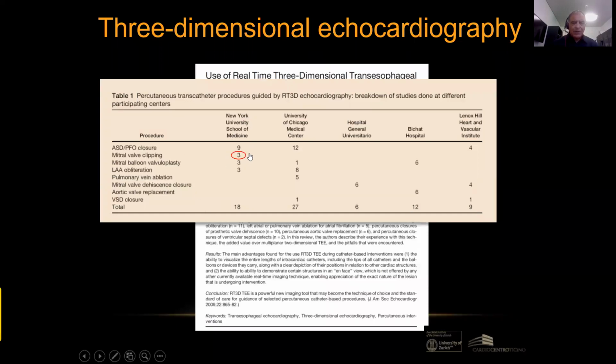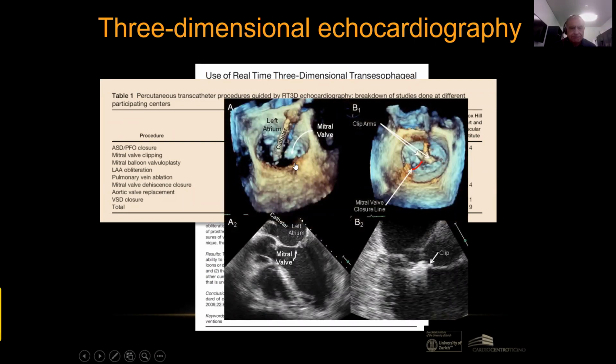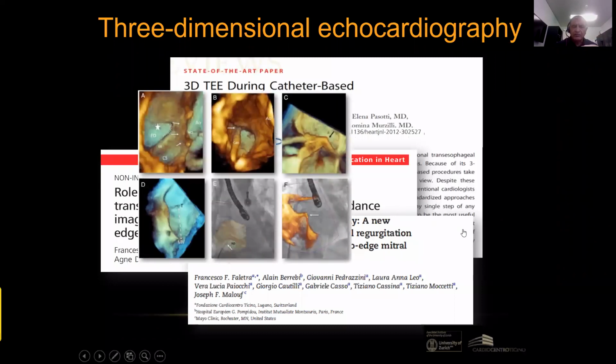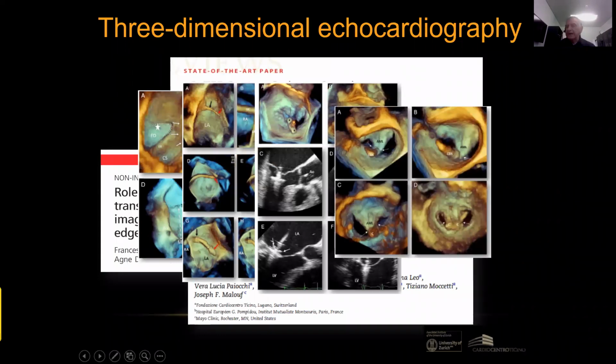But if you see this paper, only 3 patients underwent MitraClip using 3D echocardiography together with 2D echocardiography, and the images they showed in the paper were not as good as we expect. But after this paper, I personally wrote several papers in which I said, come on, we can use 3D echocardiography, not in all the steps, as we will discuss, but in many steps of MitraClip it will be very useful. In this paper, I show images in which we can use 3D echocardiography in every step of the MitraClip with the exception of grasping. In grasping, we use 2D echocardiography.